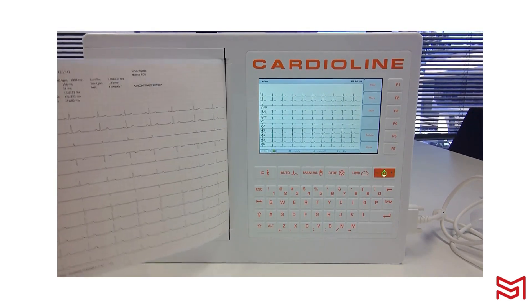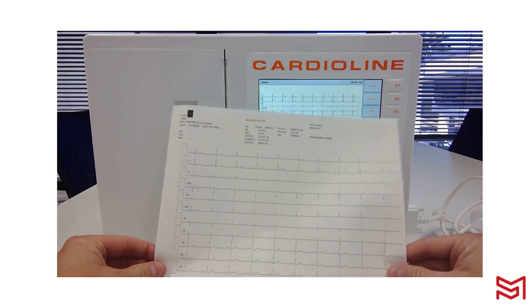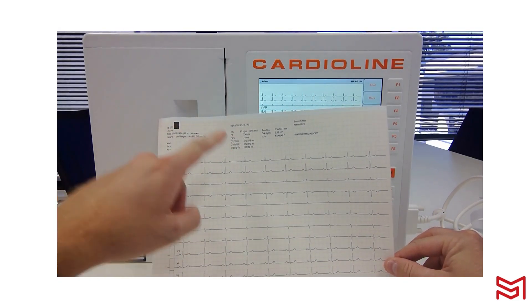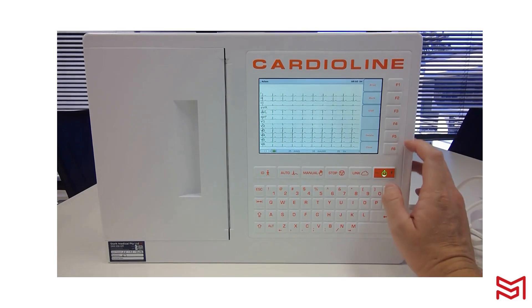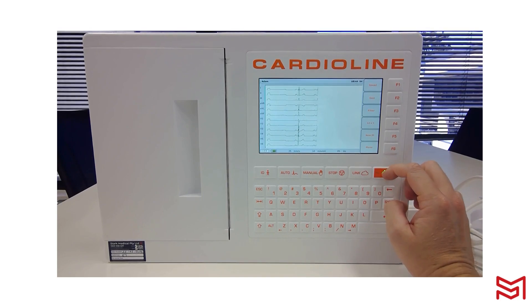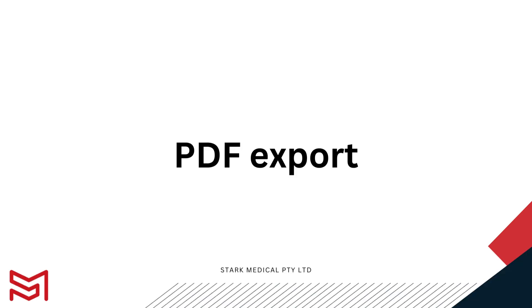If you wish to have a print preview, I'll show you how to do that later. We tear the paper off and we have a full completed ECG. As mentioned, the black mark goes over the print sensor and it will automatically cut off one perfect sheet of paper every time. To save power, you can either power down the ECG at the end of every exam or at the end of the day.